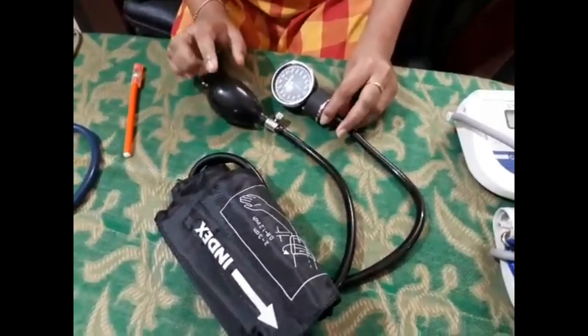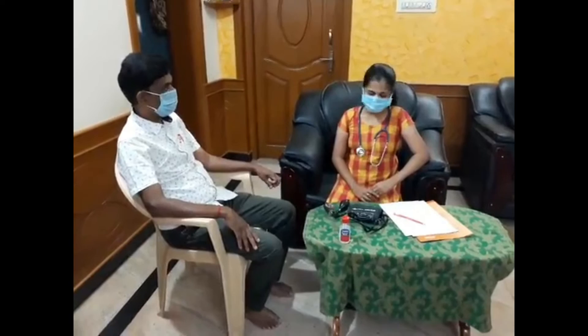This has high accuracy. I am going to take a video of measuring blood pressure. Are you okay with me? Okay. Can I know your name and age?